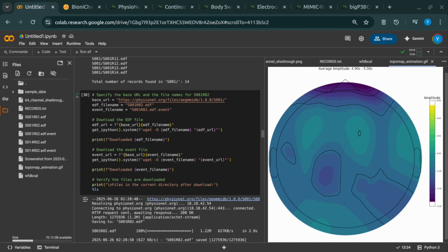Wow. A map with invisible ink, like you said before. You know there's more there, but you can't quite see it. So that leads us to epoching. The epoching saga, yes.